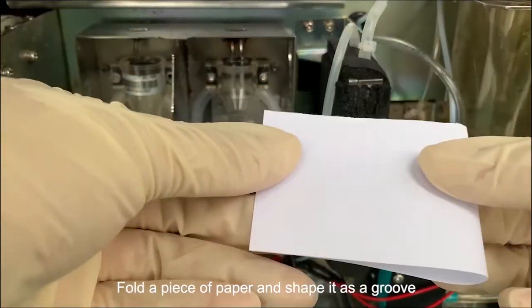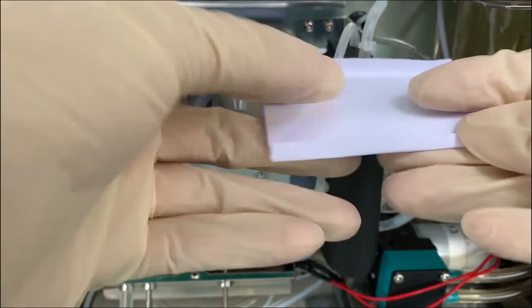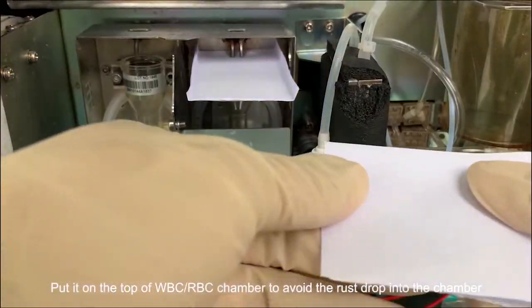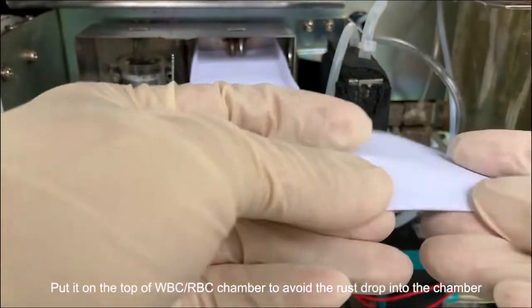Fold a piece of paper and shape it as a groove. Put it on the top of WBC/RBC chamber to avoid the rust drop into the chamber.